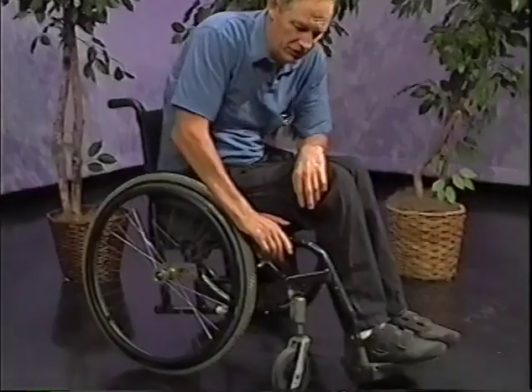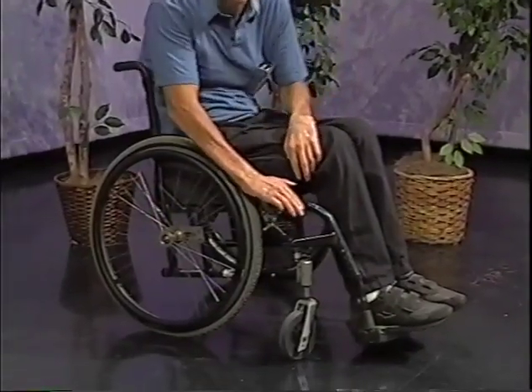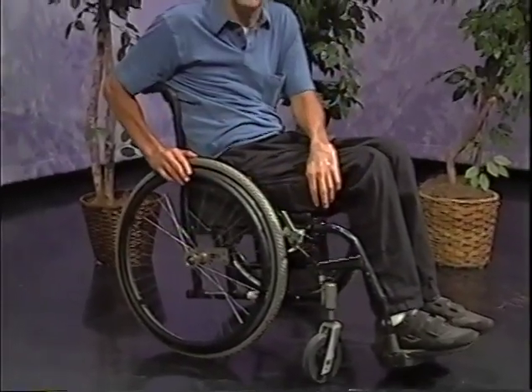Now the reason for keeping your weight on the back end of this chair is very simple. When you double the diameter of the tire, you halve the rolling resistance. So you want the bigger wheels carrying most of the weight, not the small wheel on the front of the chair. On this chair I have a 5-inch front wheel and a 24-inch back wheel.